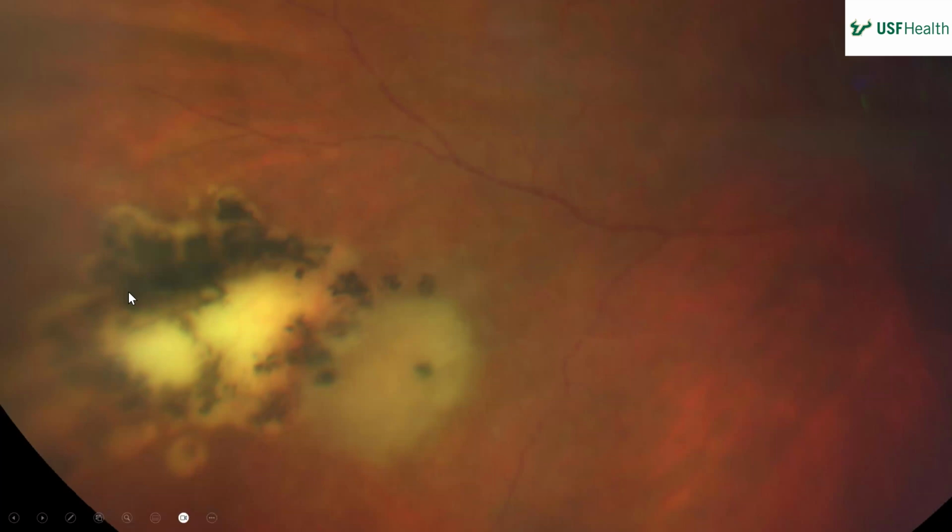So does it look like there's sort of two components to this lesion, if you look at the whole? Yeah, to me, the one to the left in our view looks a little bit more anterior to us. It looks more raised, whereas the other one looks a little less distinct and more posterior. So does one look chronic and one look more acute? From the hyperpigmentation, I would say the one on the left would be more chronic, and the fainter one on the right would be more acute. Yeah, perfect.